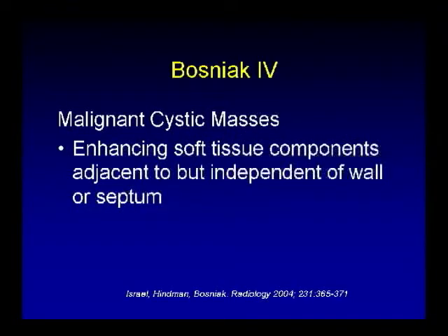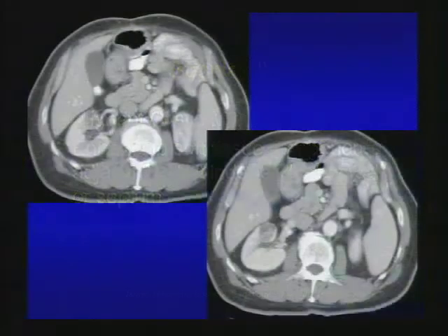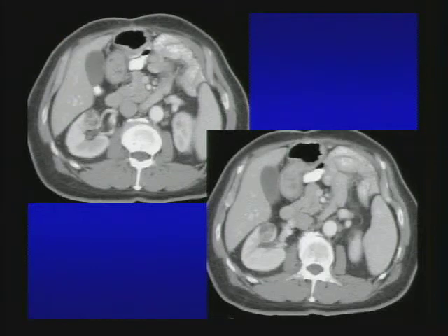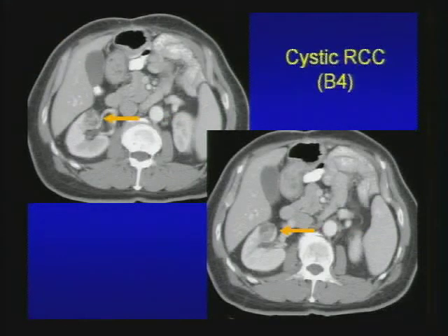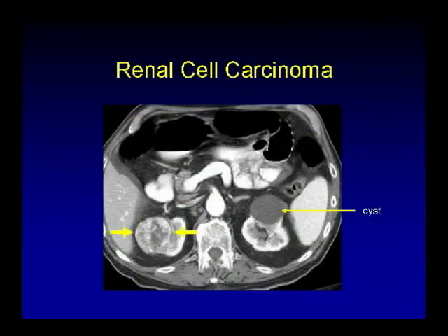Type 4 cysts are malignant cystic masses with enhancing soft tissue components adjacent to but independent of the wall or septum. Here's a case of a predominant cystic lesion with internal enhancing solid component — this is a cystic renal cell carcinoma, Bosniak type 4, needs surgical resection. And then you have the frankly solid enhancing mass, as in this example from the right kidney — renal cell carcinoma.